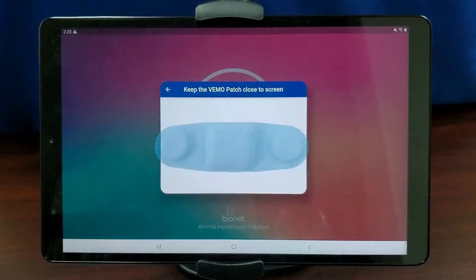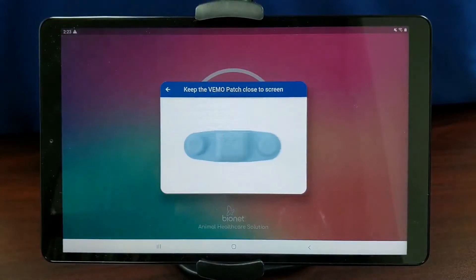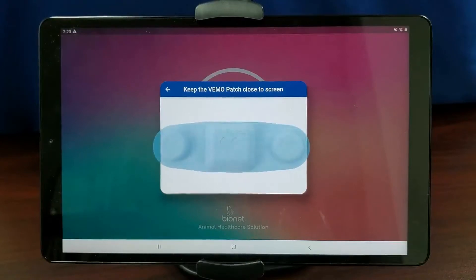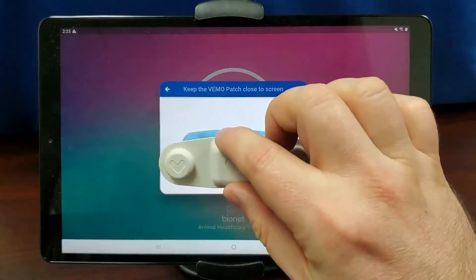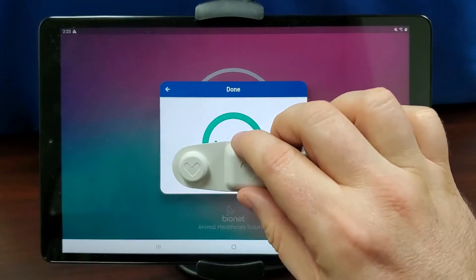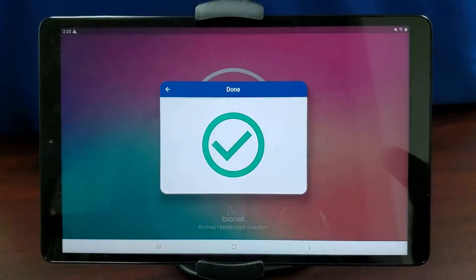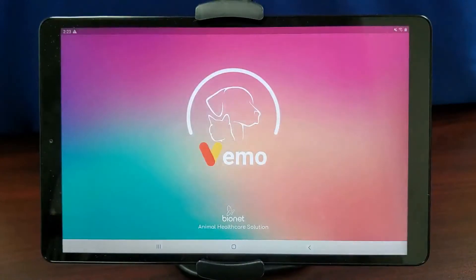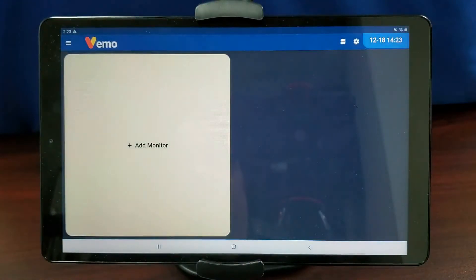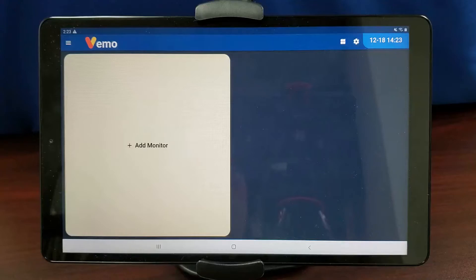Hold the Vemo sensor against the screen. Follow the directions. It may ask you to put the Vemo sensor closer to the screen, or it may ask you to move the Vemo sensor away from the screen. When it is successfully connected, the screen will say Done.